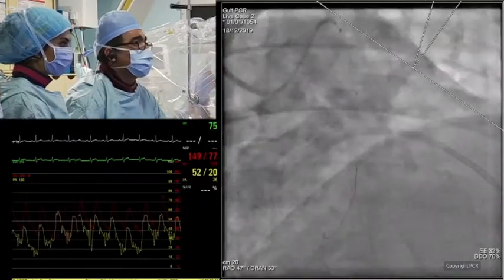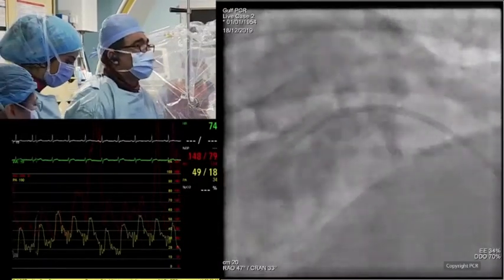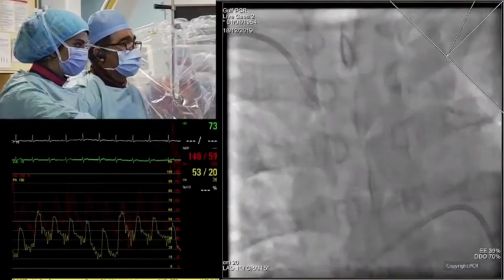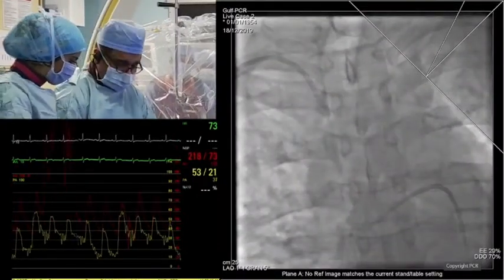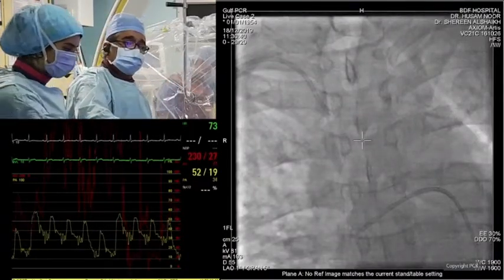Nevertheless, Hussam, I think that's a great trick to get the guide in. So what Hussam did is try to get the guide in. Now, it didn't work, maybe, I think, because the guide was too far out and it was hitting the proximal edge of the guide extension. So we'll let you get the guide in again while we discuss some more issues, Hussam. Just go ahead.